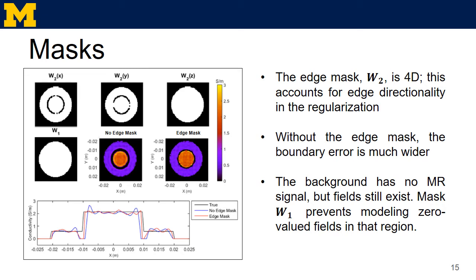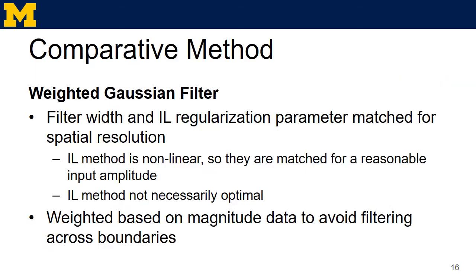And we can see that without the edge mask, that zero-valued boundary between the two compartments is much wider than when we do use the edge mask. Next, we look at the calculated conductivity results from our proposed inverse Laplacian method as compared to a more conventional method.